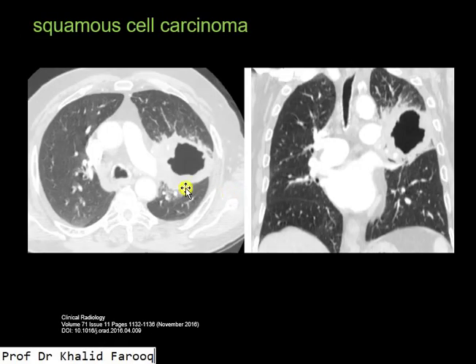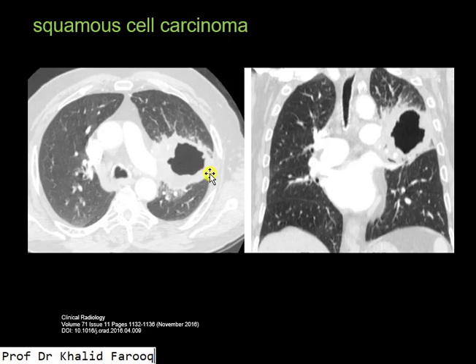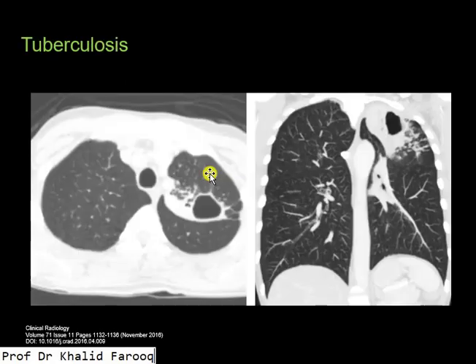This is squamous cell carcinoma — we can see there is an irregular thick-walled cavitating lesion noted in the left upper lobe. And this is an example of pulmonary tuberculosis, where we can see there is a cavitating lesion also in the left upper lobe.